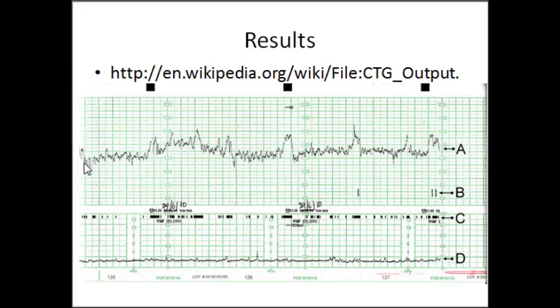But right now, just appreciate that you can see kind of a baseline. Even after the uptick, it'll return to a baseline. Over the long run, each one of these boxes, so right here to right here, is going to be, maybe I can get a pen. Here we go. Right here, right there, right there.